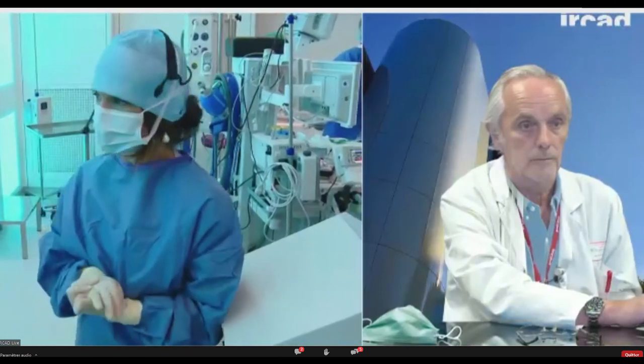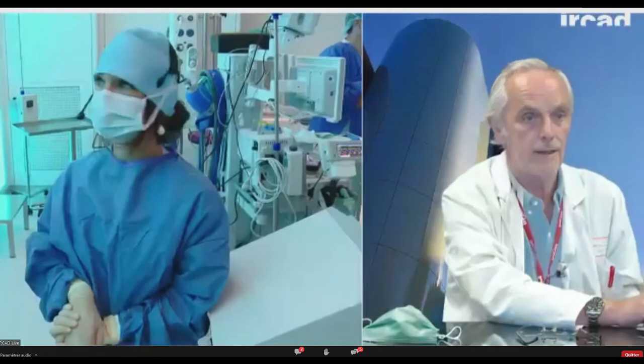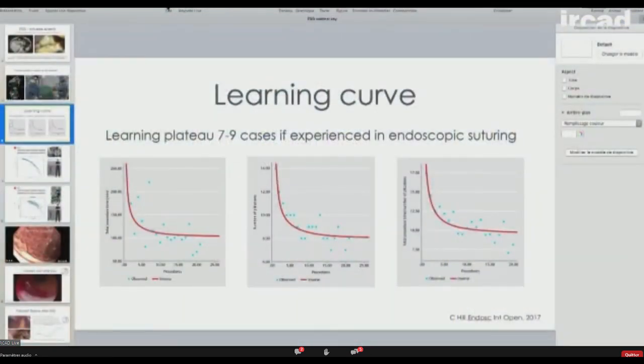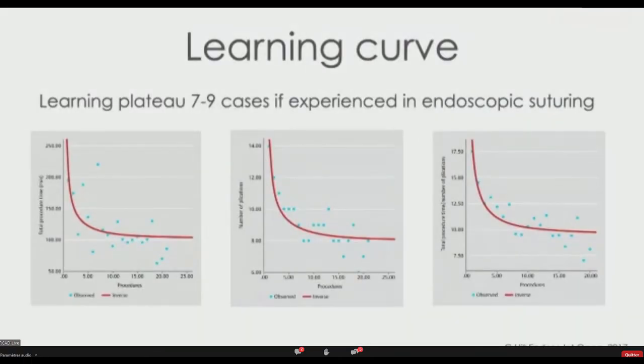I would recommend you to do so. I have also a slide on a learning curve, because there was something that was discussed during the live demo. This is a very nice study that is showing that after the first 7 to 9 cases, you reach a plateau in terms of how proficient you are in placing the stitches and completing your procedure.